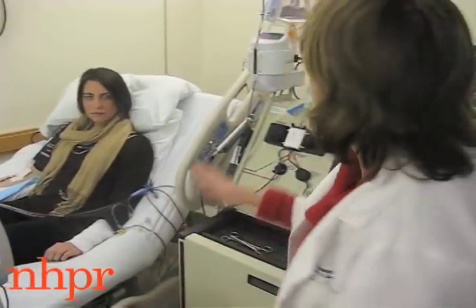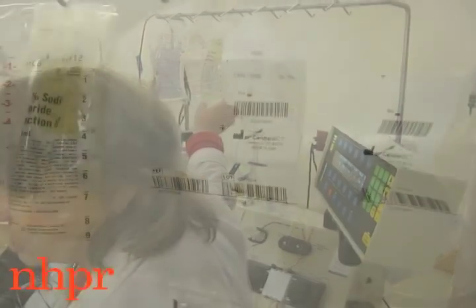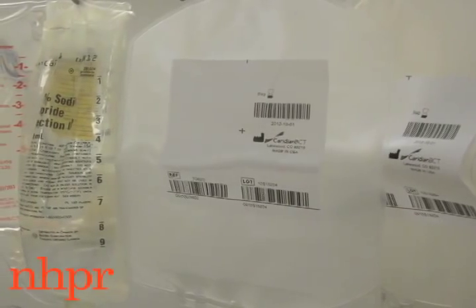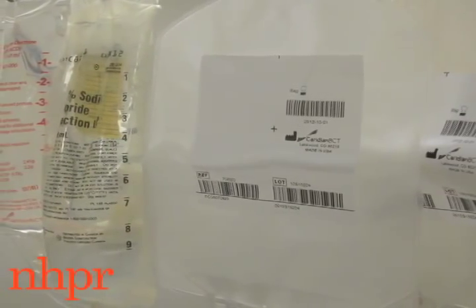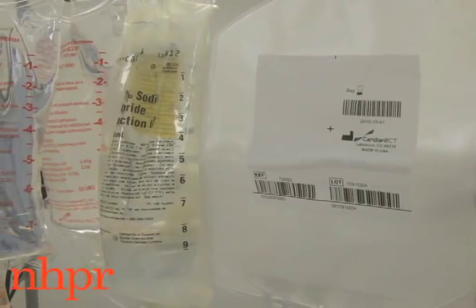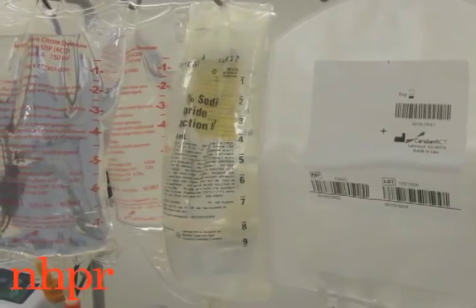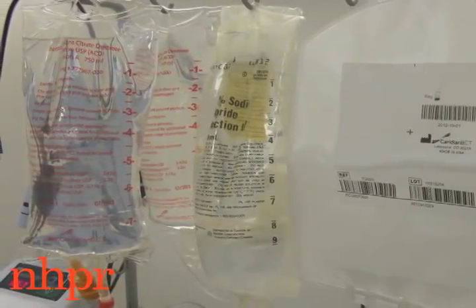The other bags — one of them is just saline, so we're giving her fluids throughout this process. And one of them is calcium, because the anticoagulant we're using will attach itself to calcium in her bloodstream and drop her calcium level, so we're giving her some calcium.